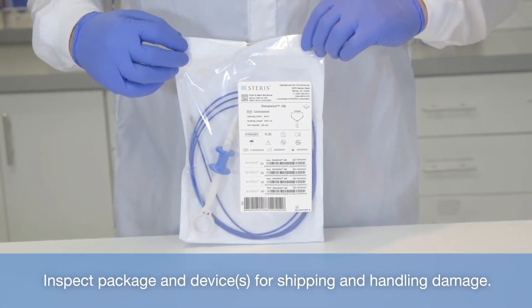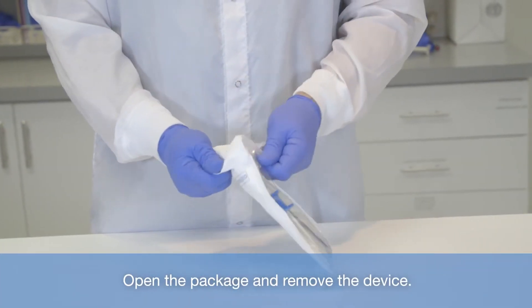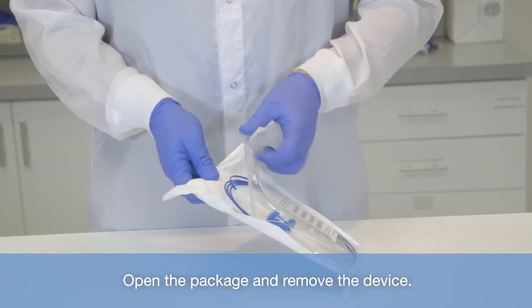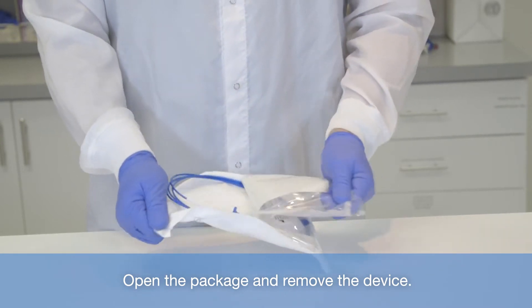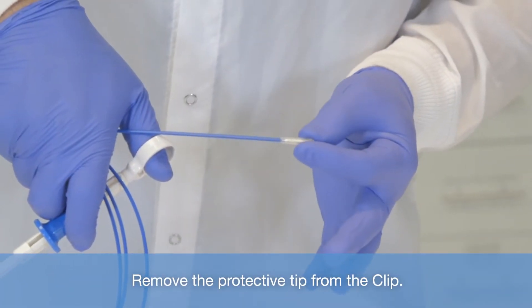Inspect the package and devices for shipping and handling damage. Open the package and remove the device. Remove the protective tip from the clip.